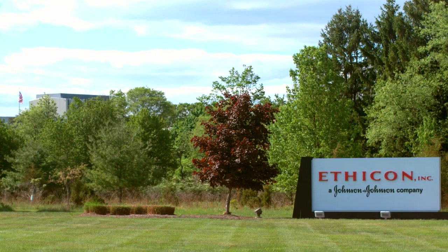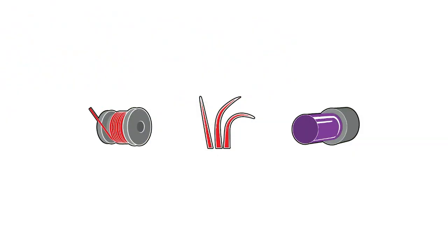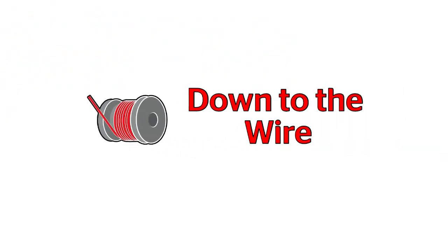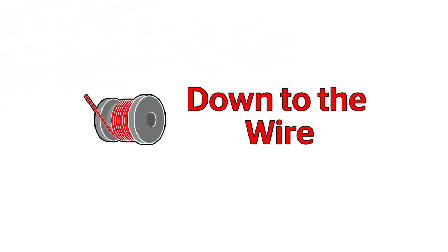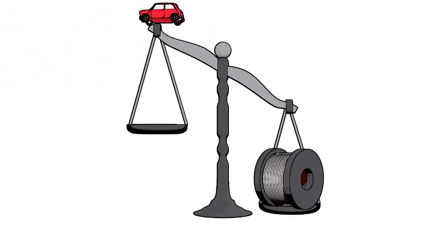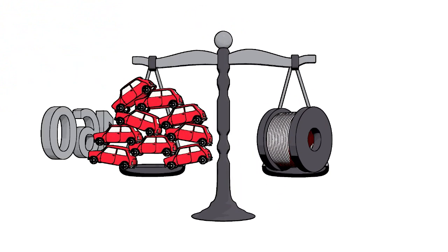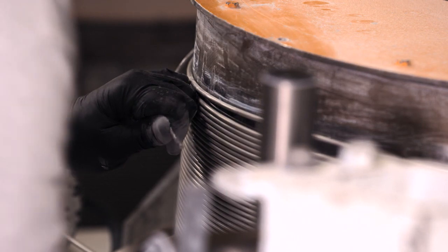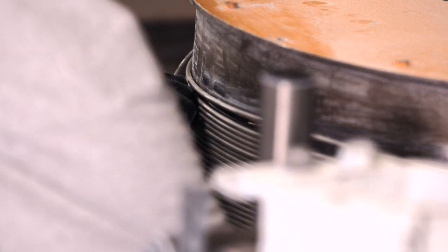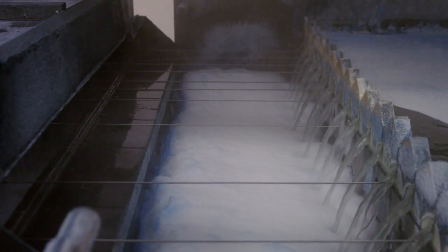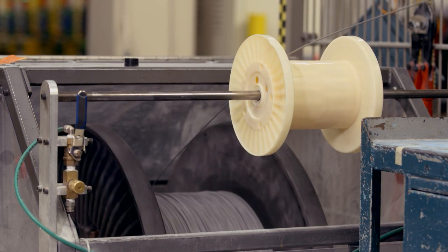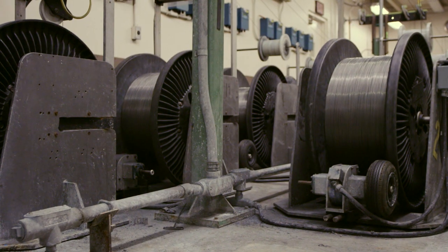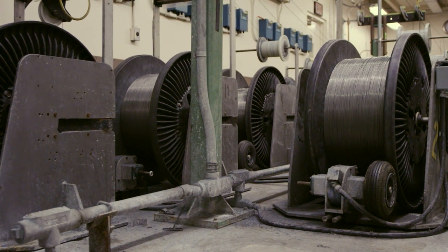Their journey to greatness starts here at the Ethicon wire mill, where each year the weight of 160 cars in wire is stretched, heated, and bathed until it reaches a precise diameter and meets stringent specifications.